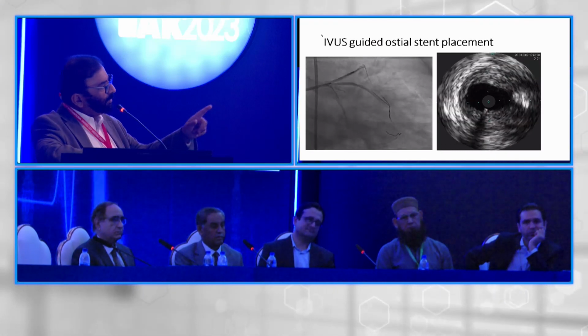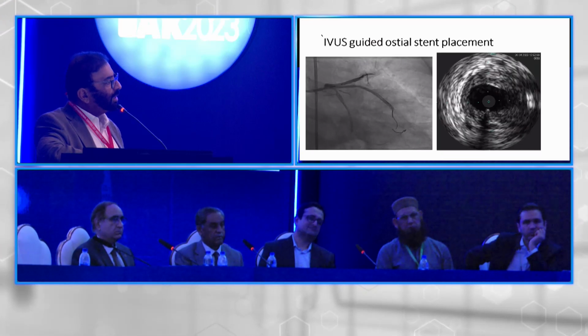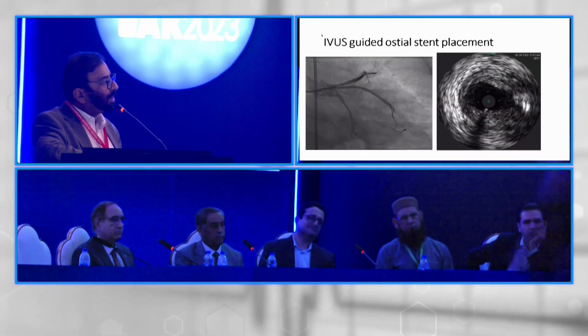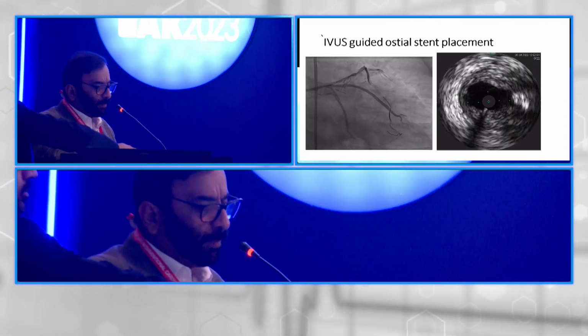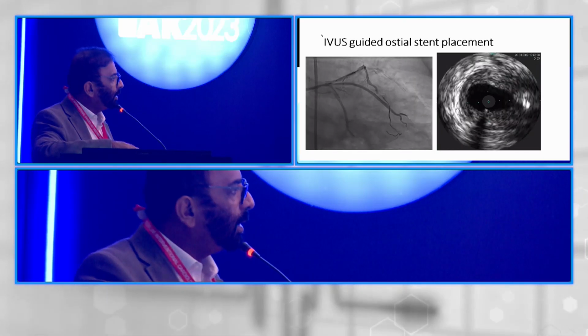And you can see we are just right there in the ostium of the circ. If you see this 3 o'clock position on your IVUS mode, you can see the stent right there. So we were quite accurately placed at this 3 o'clock for the stent. That was our strategy, as Numan was suggesting, doing ostial circ stenting with 3 wires in and under ultrasound guidance, IVUS.